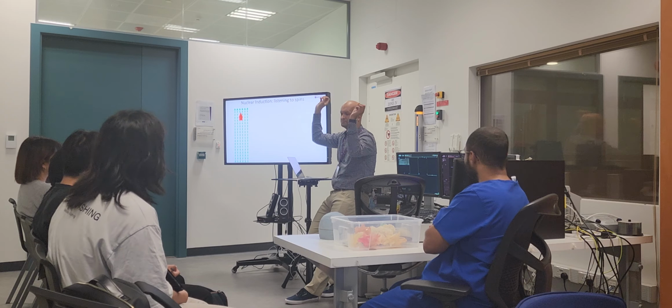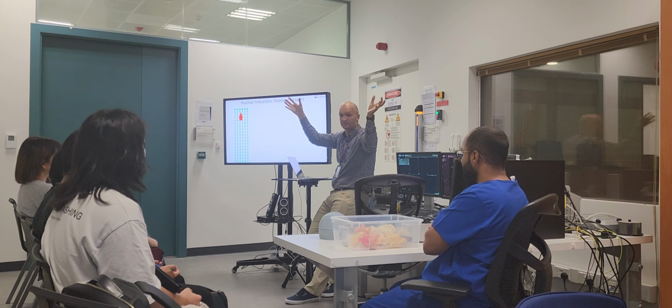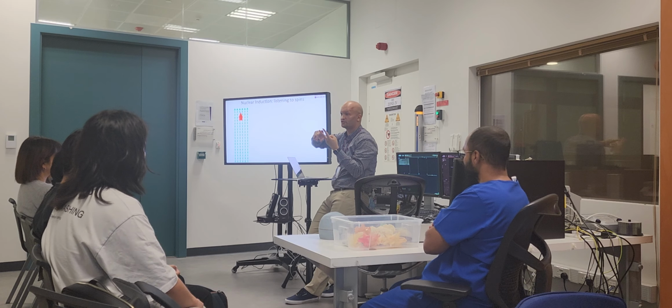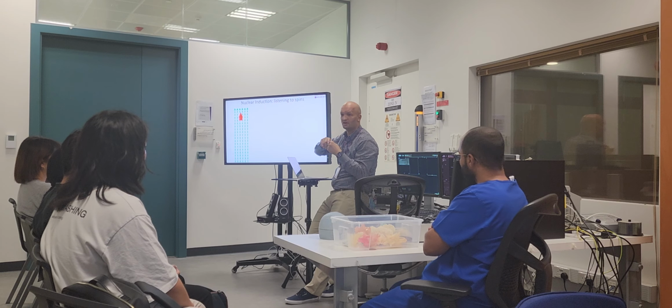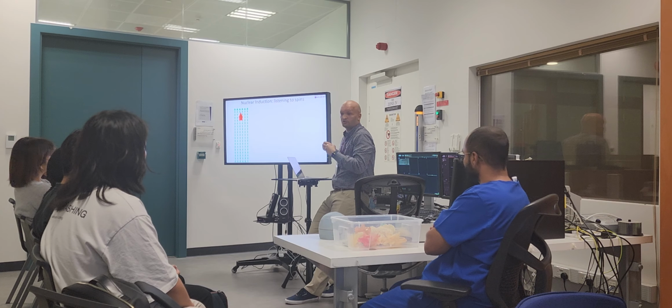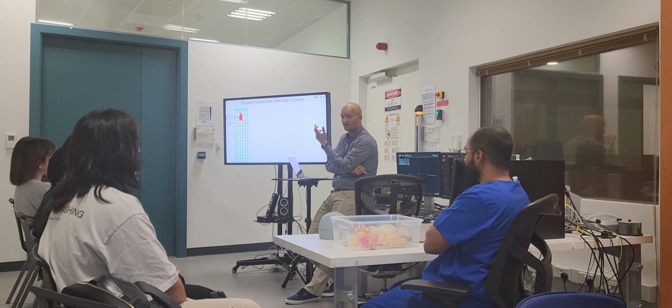Inside this arrow, you have billions and trillions of these spins precessing at a Larmor frequency. That frequency depends on two factors: the nucleus in question, for example, for hydrogen it is 42.56 megahertz per Tesla, and the field strength. That decides how fast they go. To be able to talk to them, to perturb them out of equilibrium, you can apply radio frequency pulses, okay?